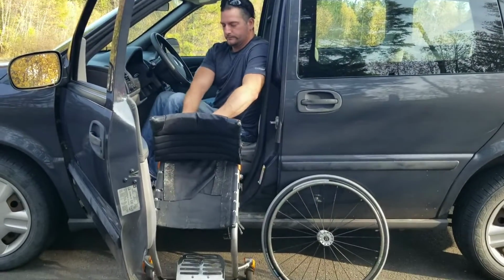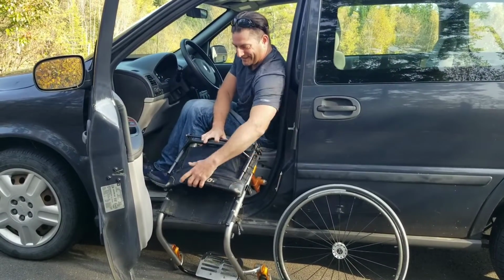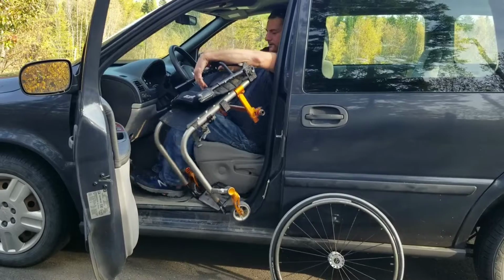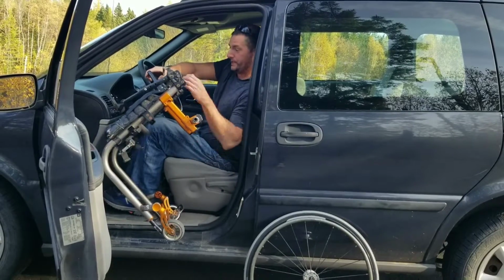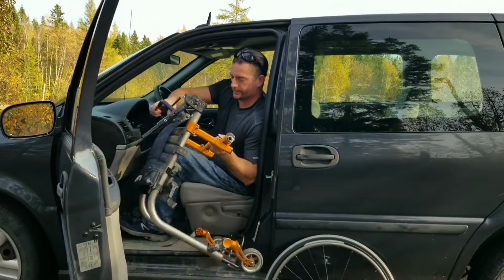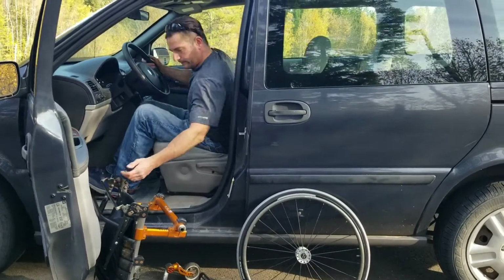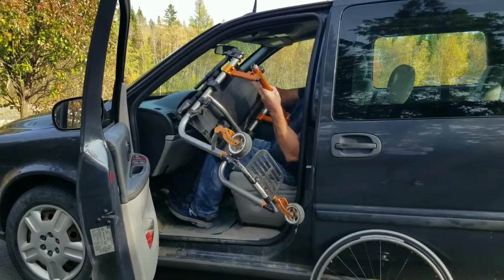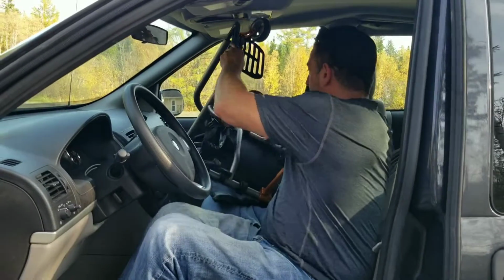Now this chair folds down. Yes, I have a quickie backrest on the chair, but that's another video why. Now this is the tricky part: bringing it across your body. Before you do that, you want to get your seat backrest as far back as you want. Now I'm going to put my chair back down here. You can tell I don't do this very often anymore, hey? So now I have the clearance to bring the chair in across and over into the passenger seat.